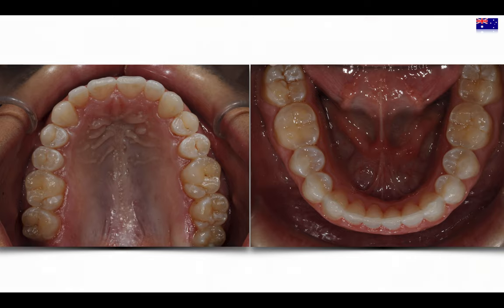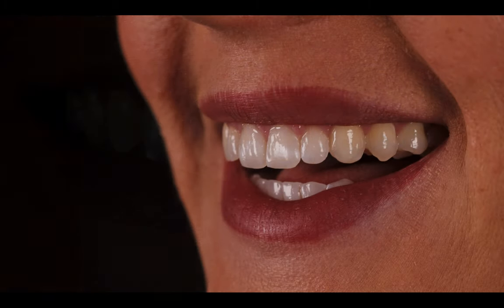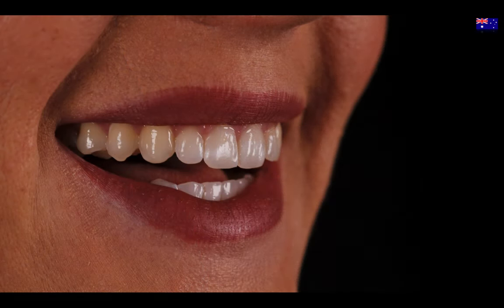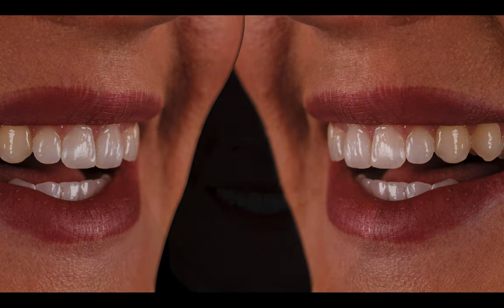With parabolic arches and a full mouth smile in balance with the face and the lips — fantastic, it's amazing. The results are incredible. Just doing a good job — look at the beautiful result and the full mouth smile.